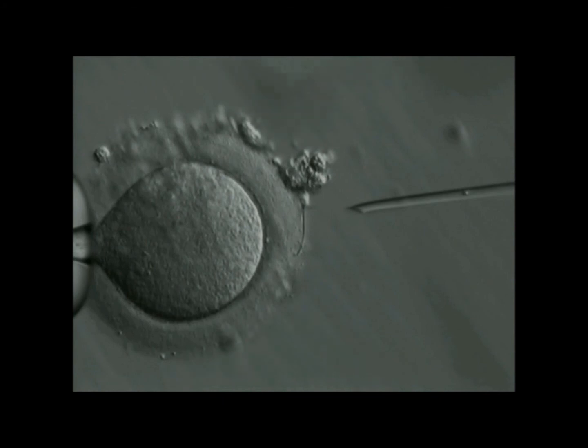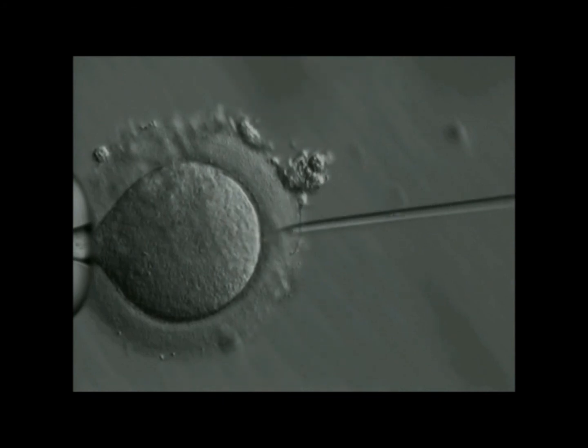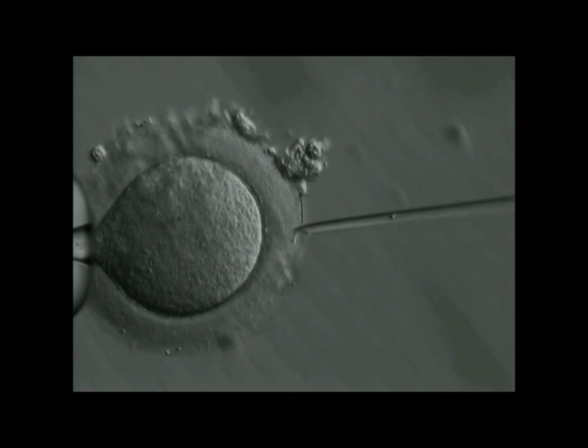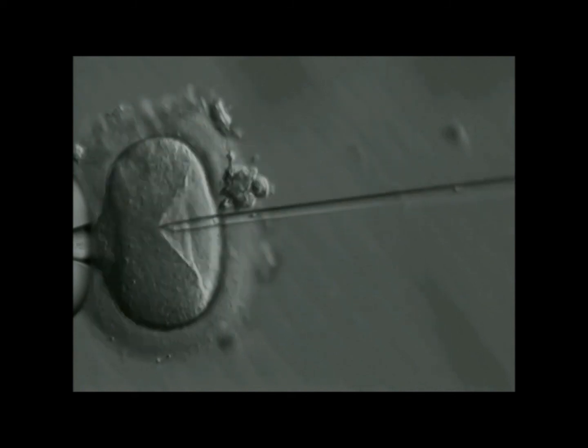In the final stage of ICSI, the mature egg is held using a micropipette under the microscope, and the sperm cell inside the microneedle is injected into the egg.